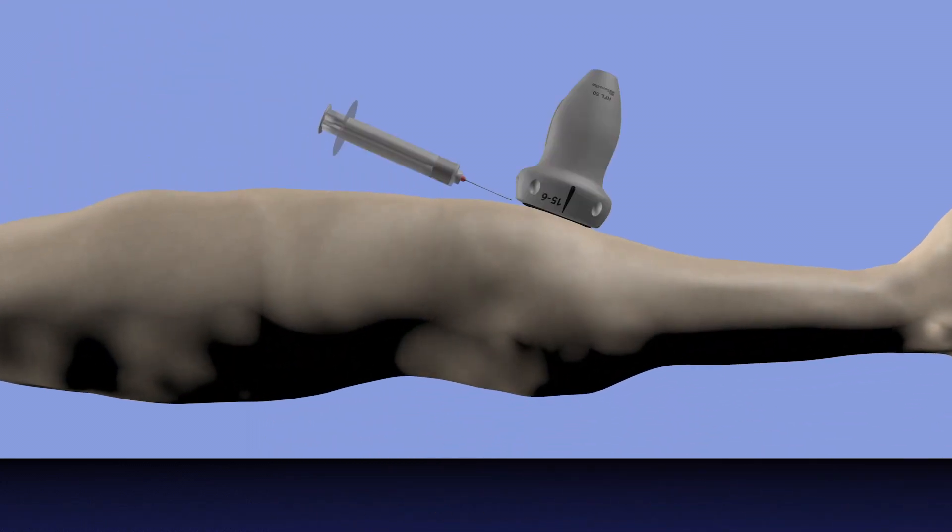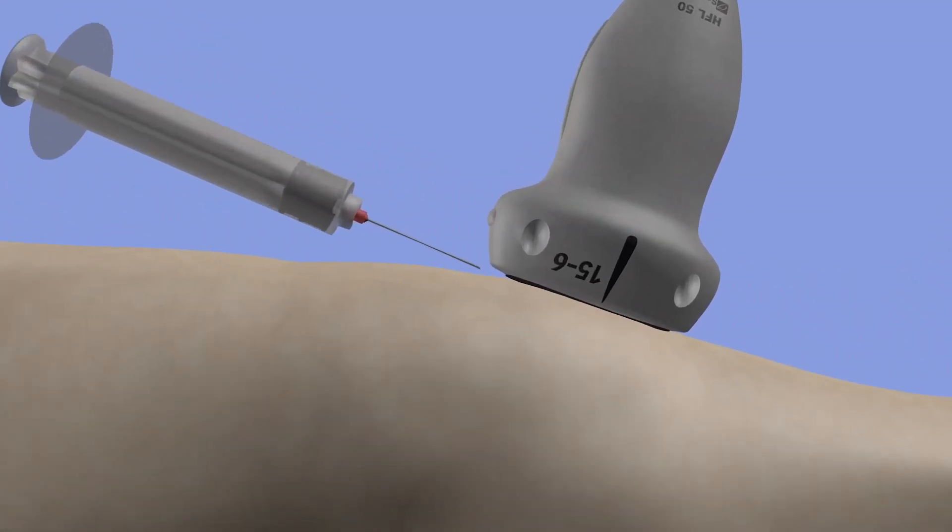Here's a picture of a normal knee where you can see the outline of the patella tendon with no significant fluid around the joint. We're rotating through the medial and lateral aspects of the knee. Now here's this lady that has a very large Morel-Lavallée lesion anterior to the patella and over the patella tendon as well. You can see how the patella itself is less distinct.